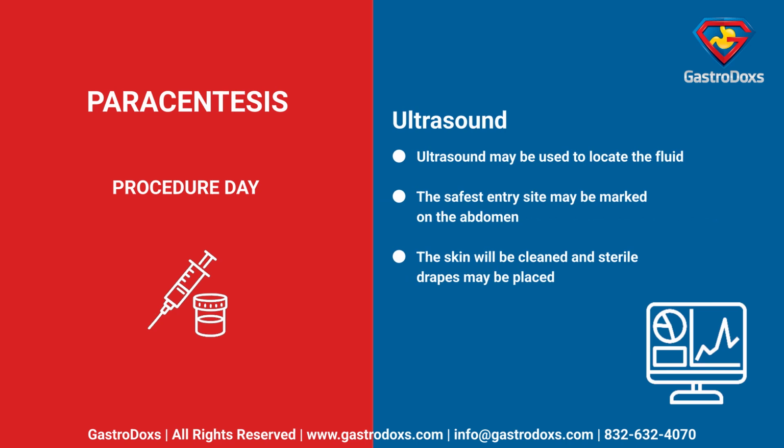Ultrasound. Ultrasound may be used to locate the fluid. The safest entry site may be marked on the abdomen. The skin will be cleaned and sterile drapes may be placed.